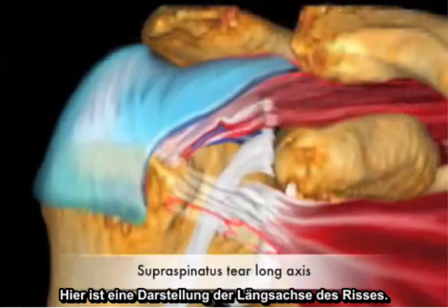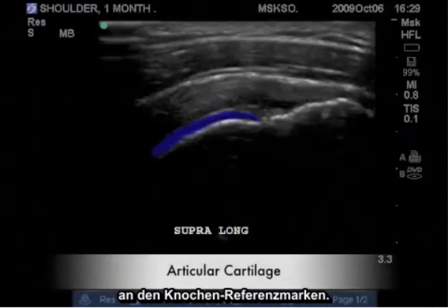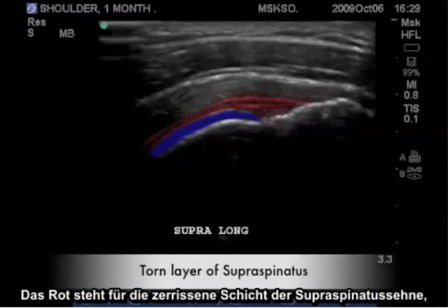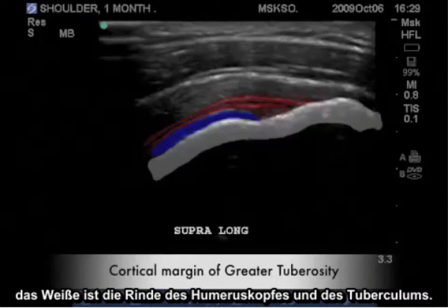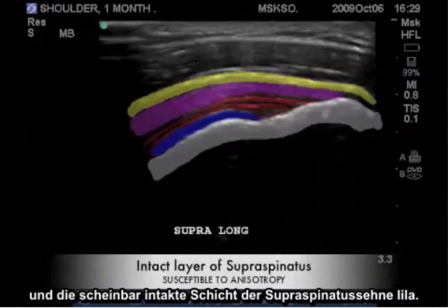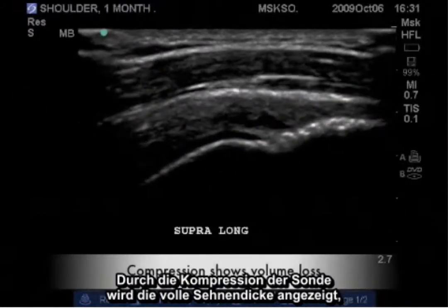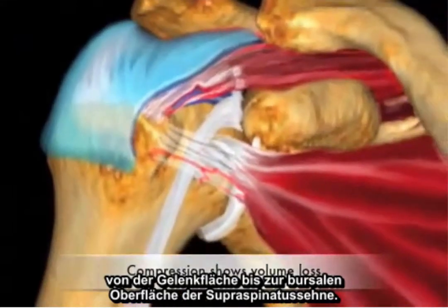Here is an illustration depicting the long axis of this tear. When imaging the supraspinatus tendon in long axis, rely on your bony landmarks. The blue represents the articular cartilage, the red represents the torn layer of the supraspinatus tendon, the white is the cortex of the humeral head and greater tuberosity, the yellow represents the peribursal fat layer, and the purple represents the seemingly intact layer of the supraspinatus tendon. It is the compression of the probe that reveals a full thickness communication from the articular surface to the bursal surface of the supraspinatus tendon.